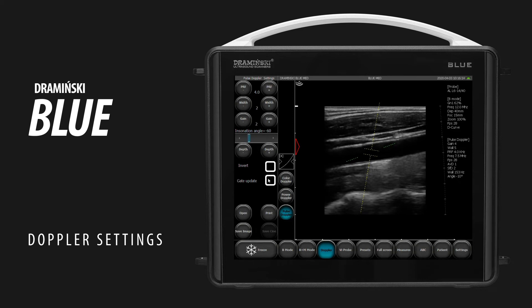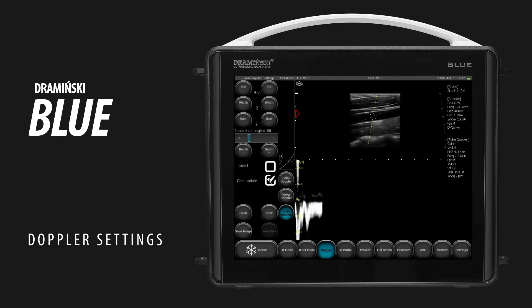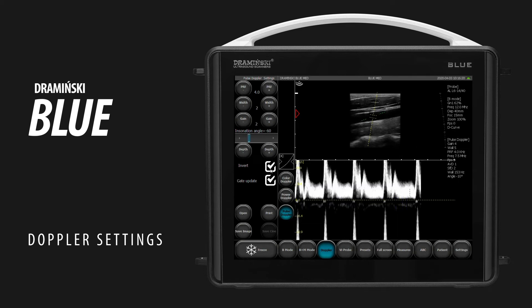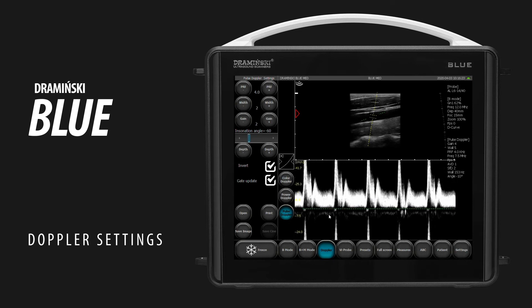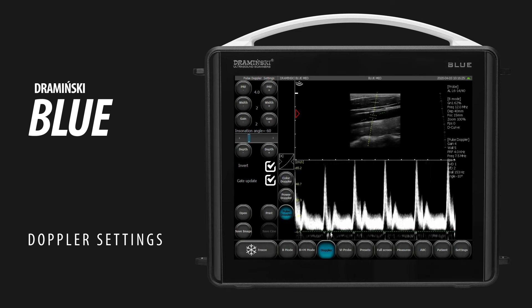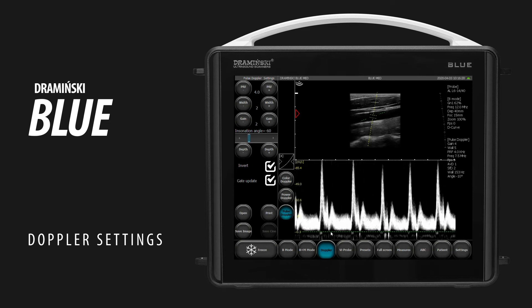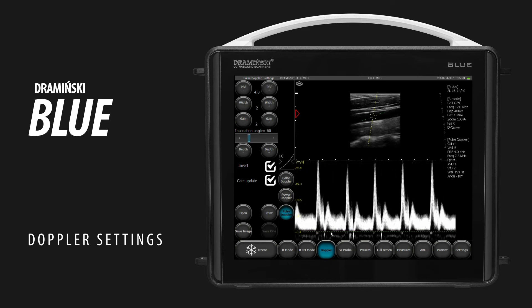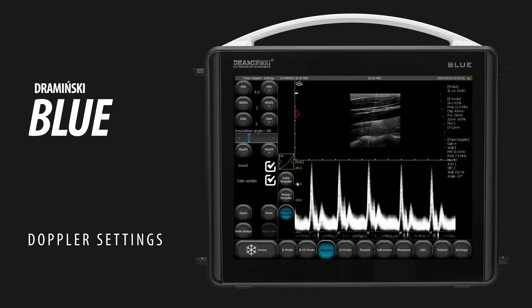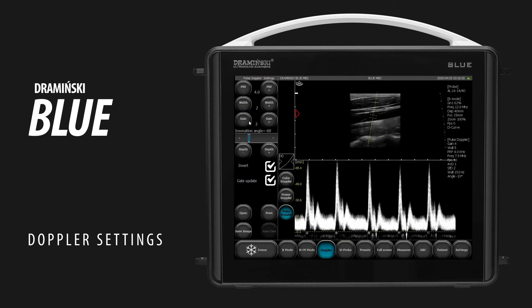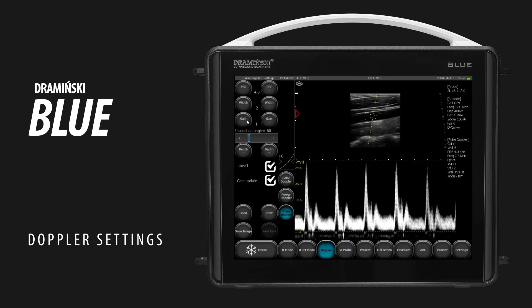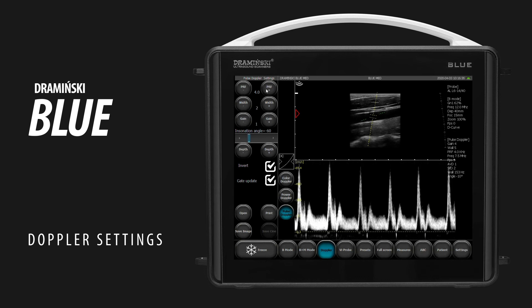Check the Gate Update box to turn on the Doppler spectrum. Check the Invert box to invert the Doppler spectrum. Drag and drop the baseline to change its position. Adjust the spectrum gain and scale if needed.